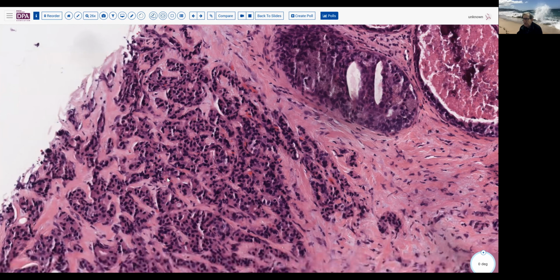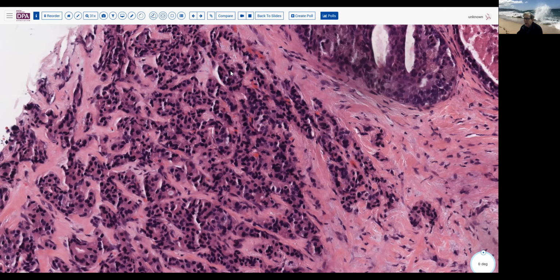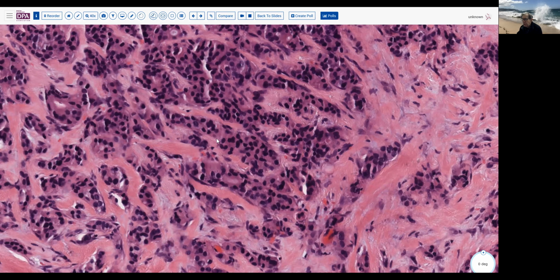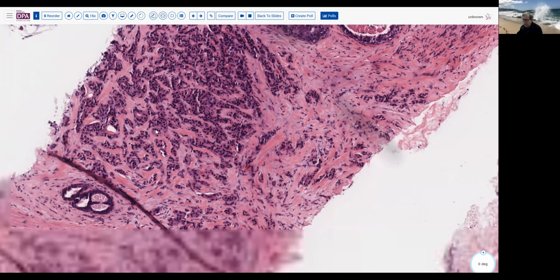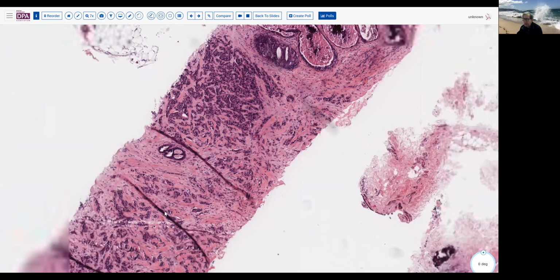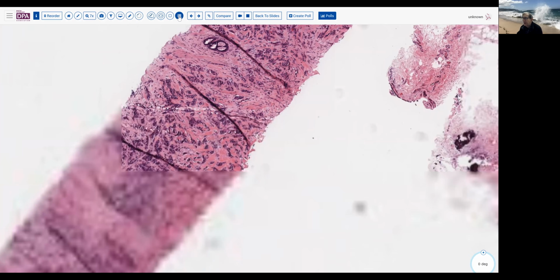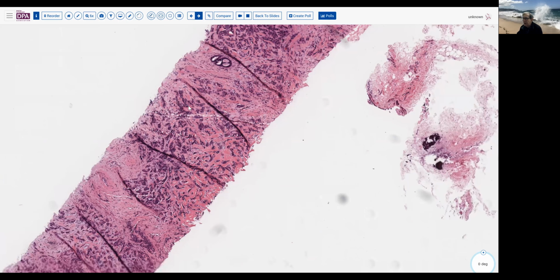And looking at this tumor, we have a few rare ducts maybe here, over here, but generally a solid pattern, small nests and cords, grade 2 nuclei, and then you conduct your mitotic count to determine. Another in situ area. And Dr. Ramsayer has come through with some annotations. I think you can see, no annotations on this one yet. All right, so we'll keep going here.